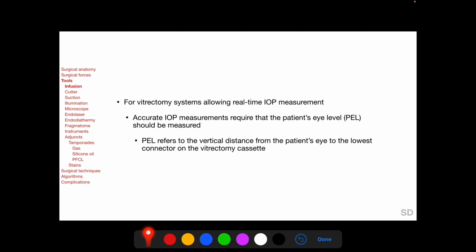Vitrectomy cutters also allow reflux, which is fluid movement into the eye through the cutter port, which can be used to dislodge tissue inadvertently engaged by the cutting port, and also can be used to separate retina from membranes to be removed. When removing the vitreous cutter, cutting should be activated to prevent vitreous incarceration at the sclerotomy, and free egress of infusion fluid from the sclerotomy ports upon removal of instruments confirms the absence of vitreous incarceration at the sclerotomies.